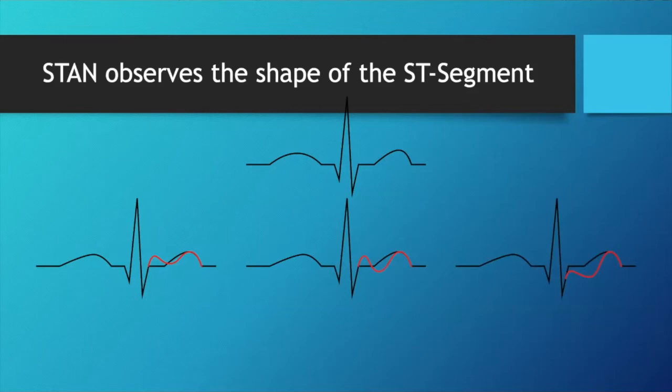So it's either going to tell you I have a problem with my ratio or I have a problem with the shape. The shape is called biphasics. The ratio is, sorry, it's telling me I have an unstable connection. Can you guys hear me still? Yeah, you cut out, but you're back.